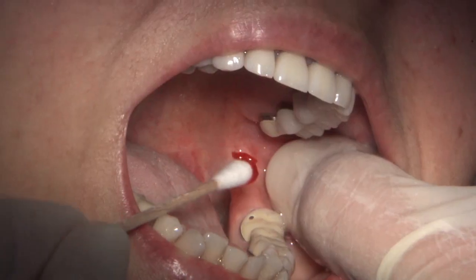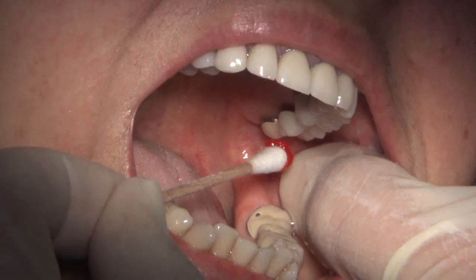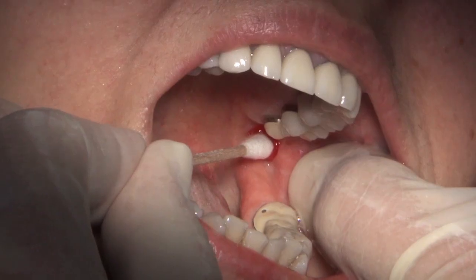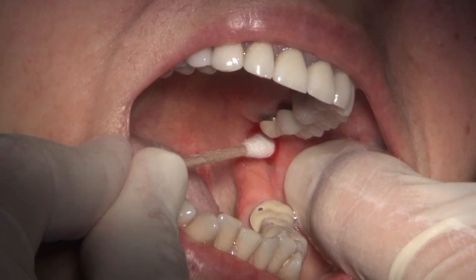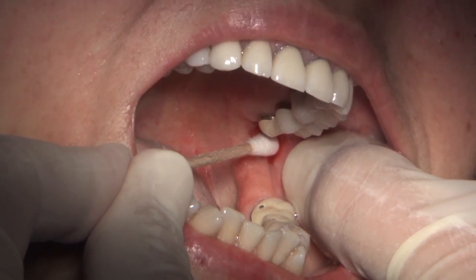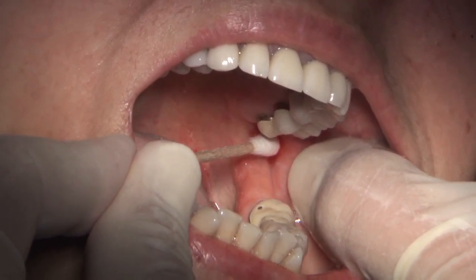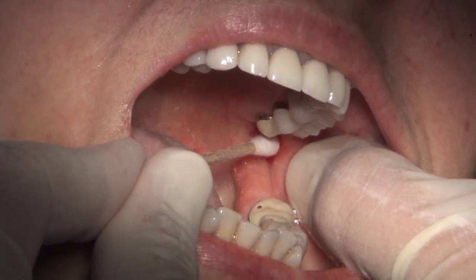I guess I get to do a dry run with the topical anesthetic. So I'm going to start from over the bicuspids on the opposite side, go to the height of the mesiolingual cusp of the first molar, then move distal to the second molar and place the topical there. How does that look to you? That looks good — good injection point. That's a good example of how it's not a steep angle up, given how far she can open. I'm looking at that angle and it looks pretty close to the angle of my finger, like you mentioned. It's subtle — not drastic, not pointed at magnetic north.